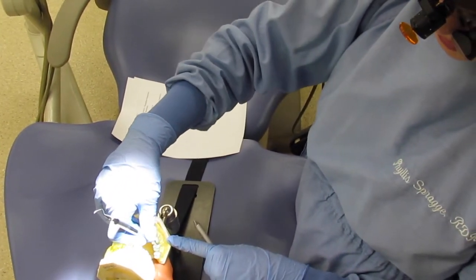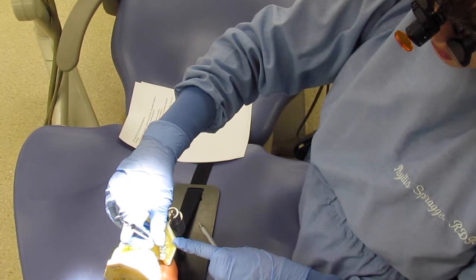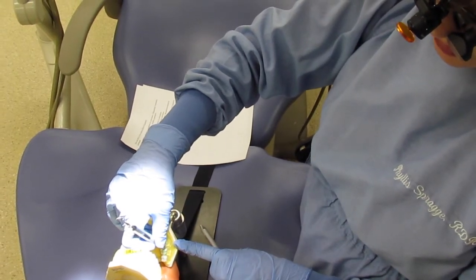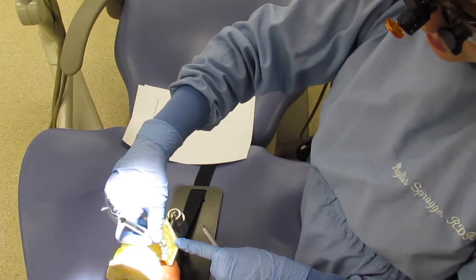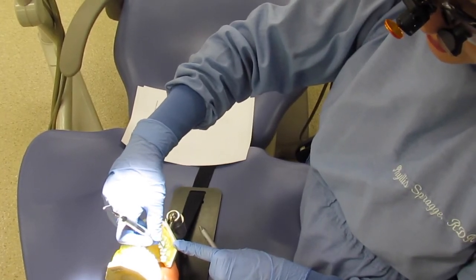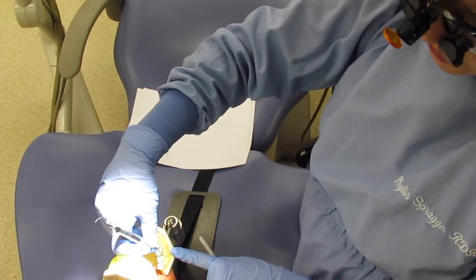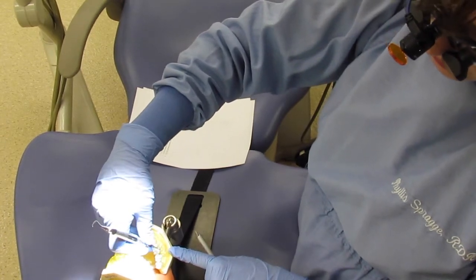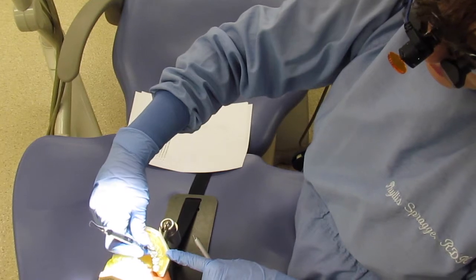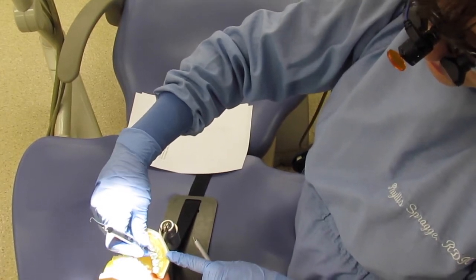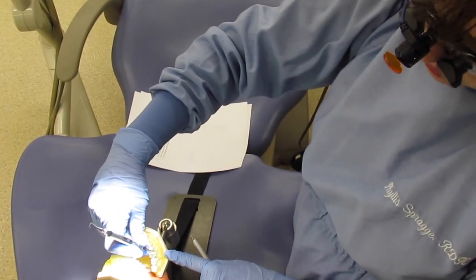Bring it out. Reestablish your fulcrum closer to your working area. Raise it up toward the upper teeth so you're nice and parallel. Then initiate oblique rocking strokes, turning as you come around the mesial line angle, not dropping your handle but staying up parallel so the secondary blade stays closed.